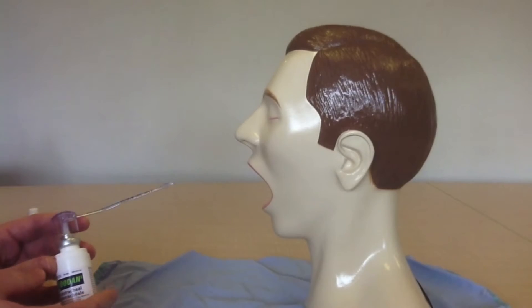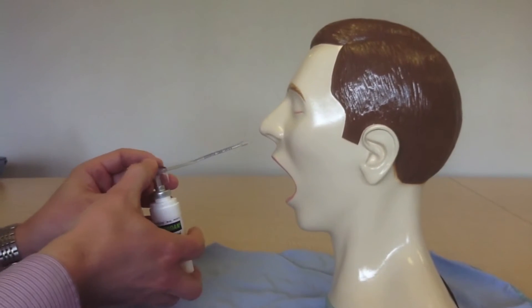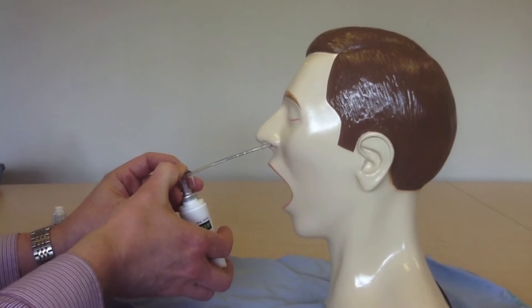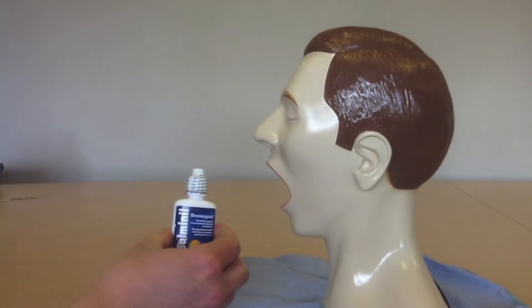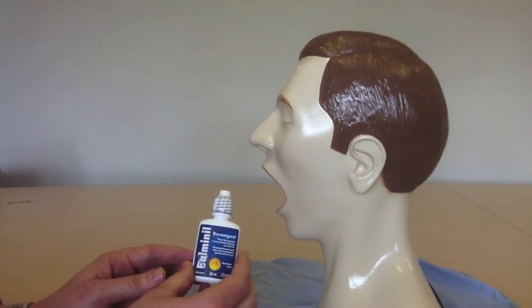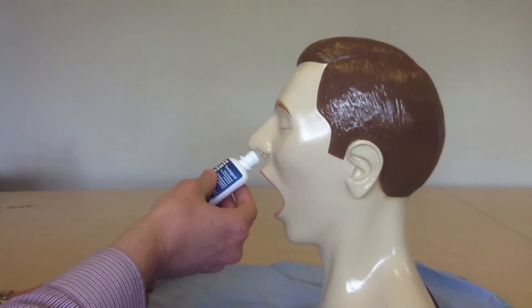In order to provide adequate analgesia for the procedure, it is best to apply the topical lidocaine by applying it into the nares with 2-3 sprays. You can also use a topical decongestant if there are no contraindications based on the patient's health. Simply apply into the nares of interest.